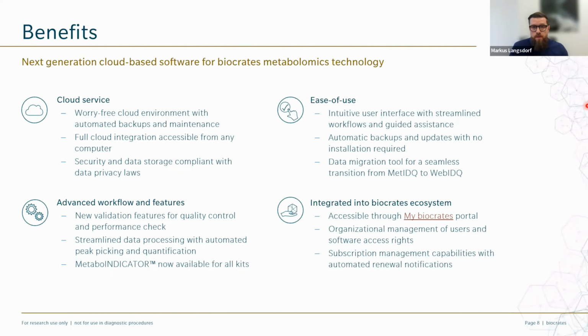The workflow is quite simple and intuitive, and there is also a user manual available online directly in the application. Backups are generated automatically and regularly. You don't need to install anything manually and always have access to the latest software. For existing MetIDQ users, there is an easy-to-use tool that automatically migrates the MetIDQ database to WebIDQ.